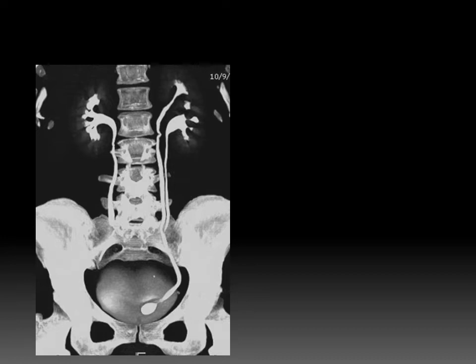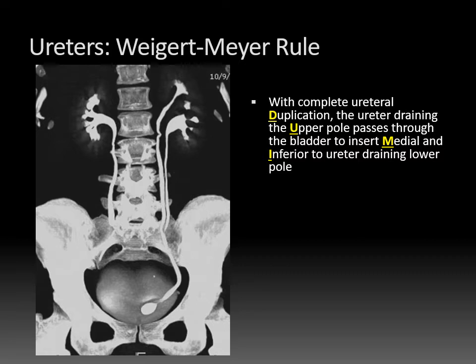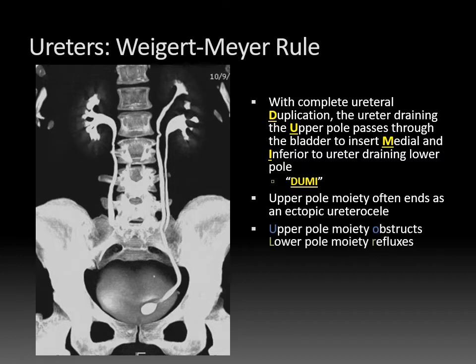Looking at a different case — an excretory phase coronal MIP reformat — the right kidney has a normal collecting system with a single ureter, but the left kidney has a duplicated collecting system and two ureters. When we have complete ureteral duplication, the Weigert-Meyer rule applies: the ureter draining the upper pole moiety passes through the bladder to insert medial and inferior to the ureter draining the lower pole — remember this with the mnemonic DUMI. Usually the upper pole moiety ends as an ectopic ureterocele, seen here as a dilated region of the distal ureter with a cobra head or spring onion appearance. The upper pole moiety tends to obstruct, whereas the lower pole moiety tends to reflux — upper obstructs, lower refluxes.